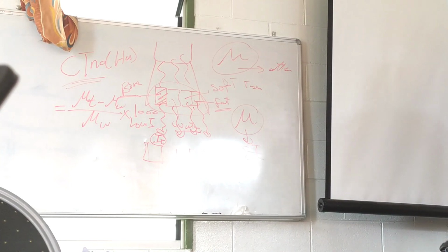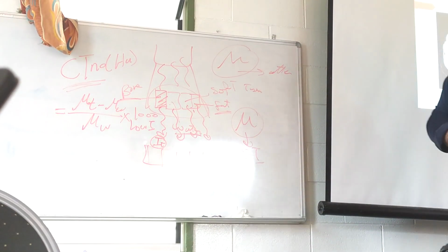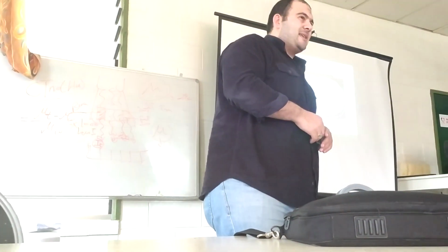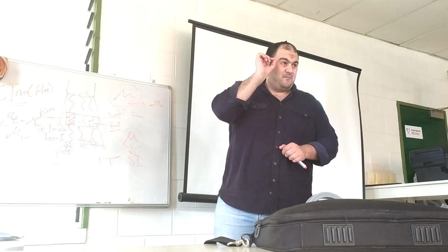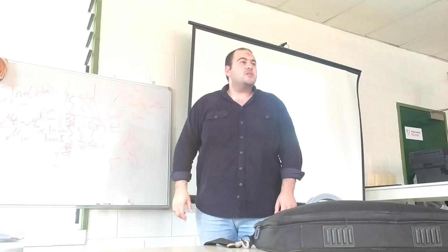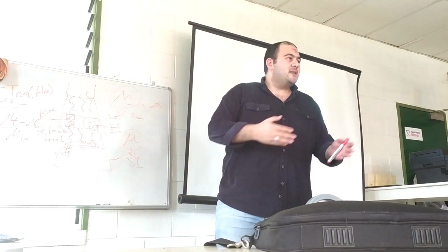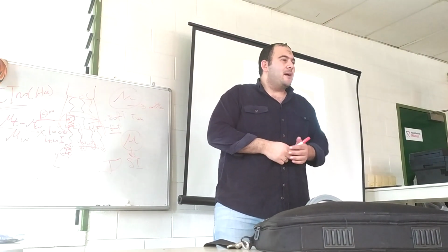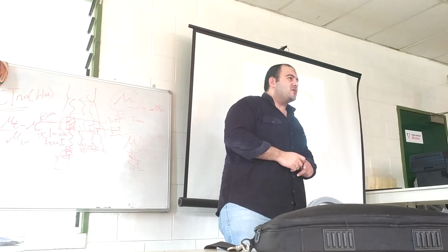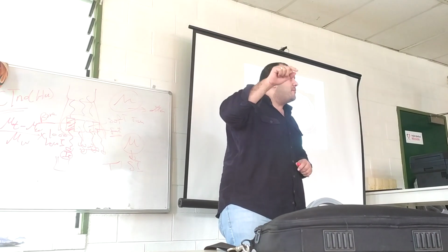This is very important. Why is it very important? Because sometimes you will scan a patient for renal stones. You want to know the type of renal stones, which is urate or calcium oxalate, and so on. Through this CT number, you will find that each type of renal stone has a specific CT number, called Hounsfield unit. Sometimes you will find hemorrhage in the brain, and you differentiate between hemorrhage and calcifications using these CT number values.